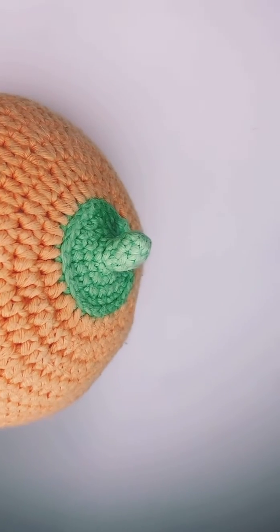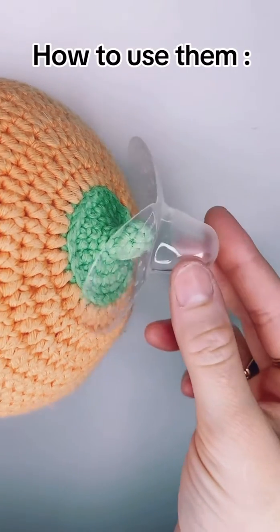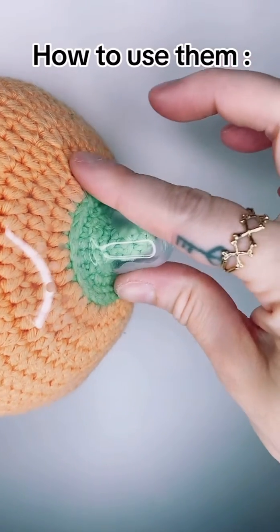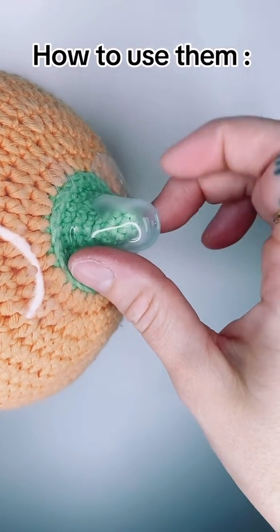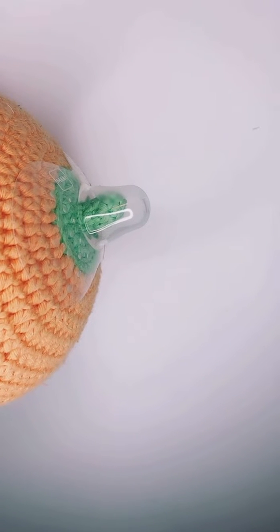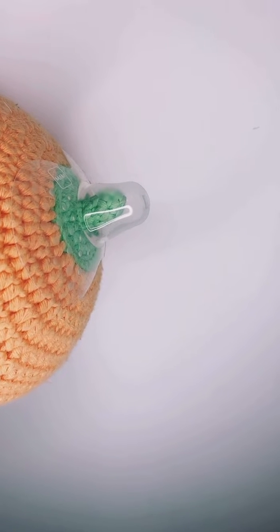In order to apply a nipple shield, simply apply a little bit of breast milk or nipple balm on the shield and wear over your nipple such as that. Baby's mouth will then go around here, and their nose should touch the area that hasn't got any of the silicone from the shield. They then create a nice extension that reaches further into baby's mouth, and that can sometimes help trigger a stronger latching reflex, but generally also helps with latching overall.